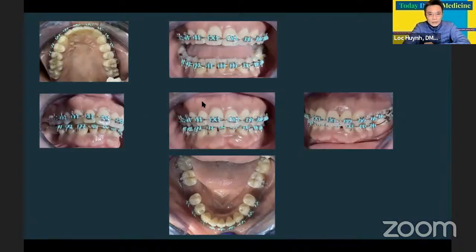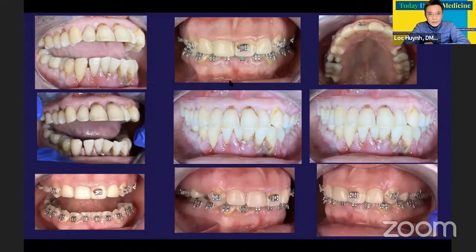Again, just a similar photo to what I showed you before. This is a photo that we took with an iPhone, with some light coming out of the divider I showed you previously. You see this gum infection there. So yeah, look at that. You want to take retraction like that, retract everything, and show everything that needs to be recorded. So when you take a photo, look for the detail.